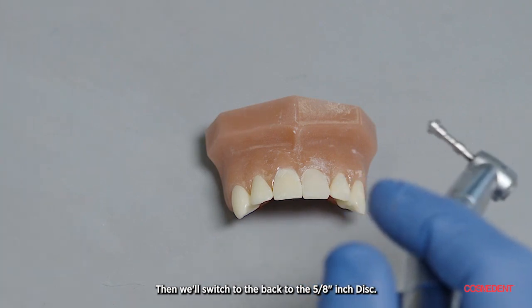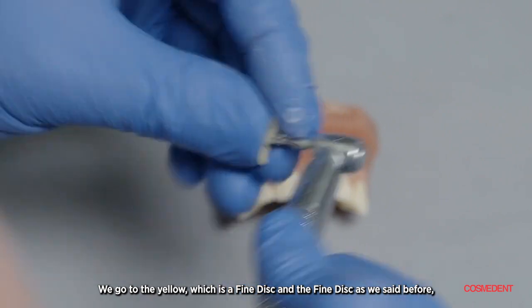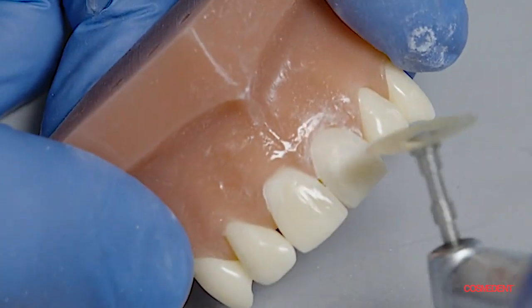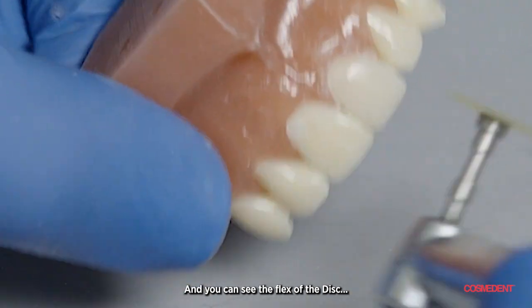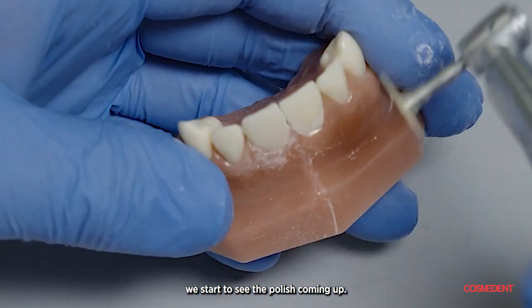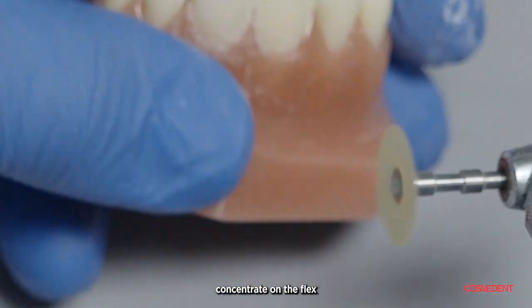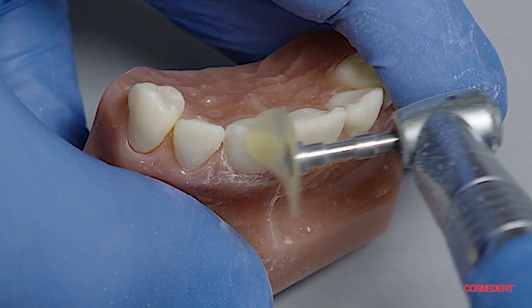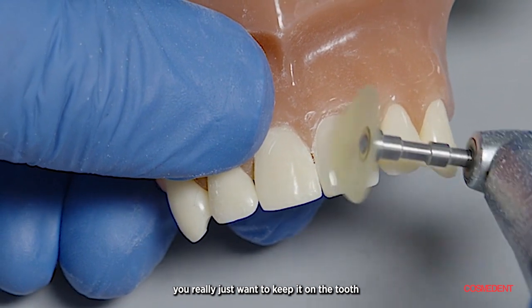Then we're going to switch back to the five-eighths inch disc and go to the yellow, which is the fine disc. The fine disc will start the polishing — watch how easy this polish comes up real quick. You can see the flex of the disc and the polish coming up. With the fine disc, you really just want to keep it on the tooth to get that polish. Concentrate on the flex of the disc.